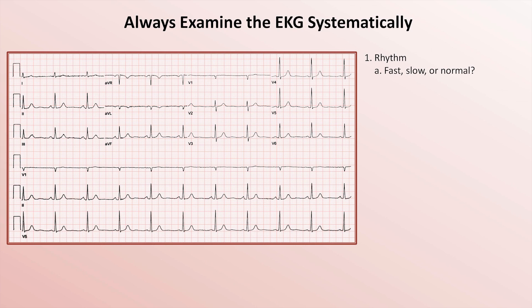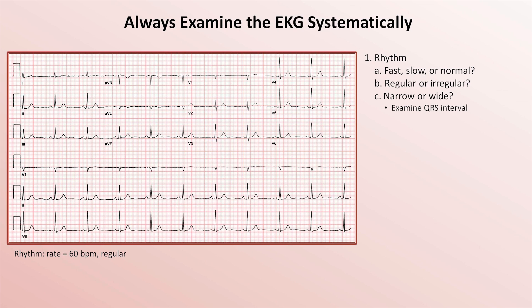Part B: is it regular or irregular? Here it's regular. Part C: is it narrow or wide — meaning a narrow or wide QRS complex? In other words, is the duration of the QRS interval within normal or is it long? This one is narrow complex.